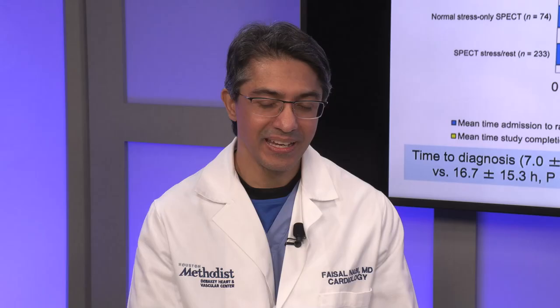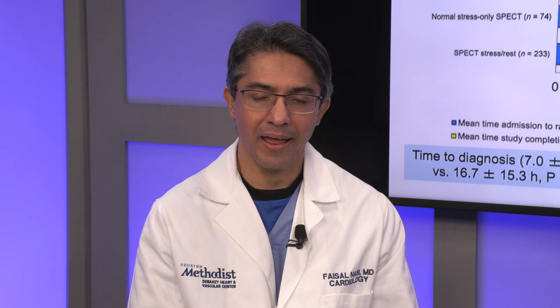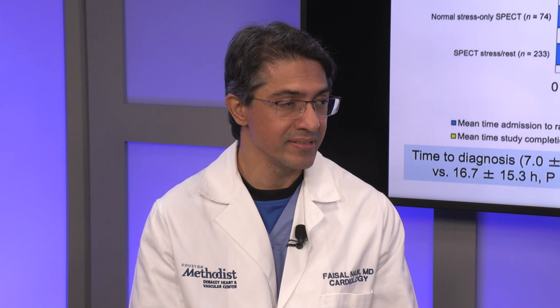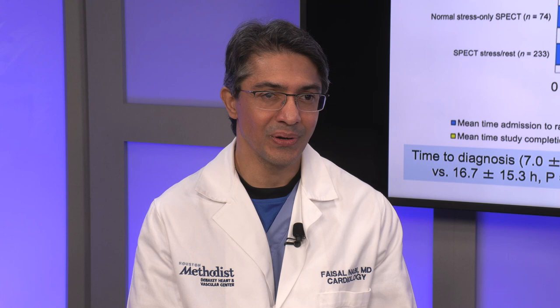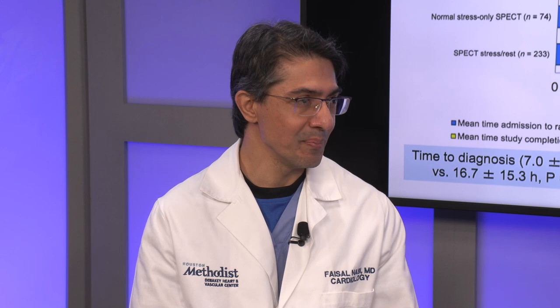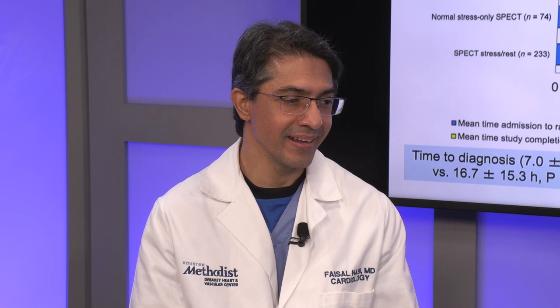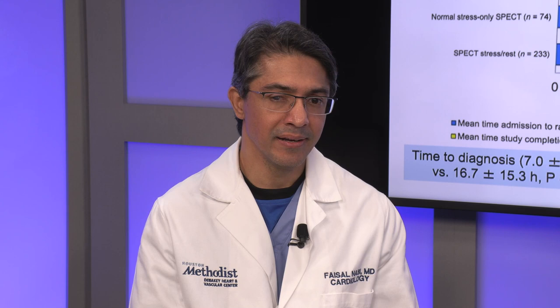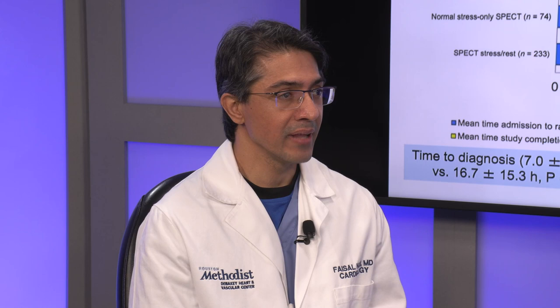That's a great question, Dipan. And there have now been at least 2,000 patients in publications in the literature, which have shown that this possibly could be a very safe technique. Now, there is no study that has shown this where you prospectively had a calcium score and sent the patient home. And the difficulty I know we've had at our own institution incorporating this is that the standard of care is moving. But at least in the low to intermediate risk population, data from several different sites has shown that this could be a new gatekeeper and definitely needs to be investigated further.